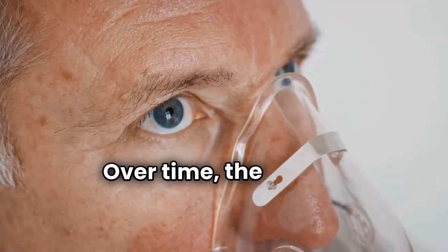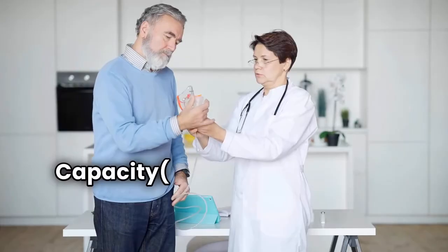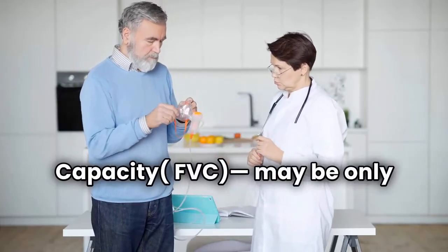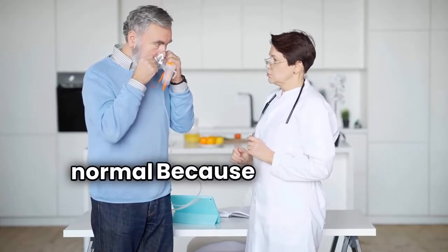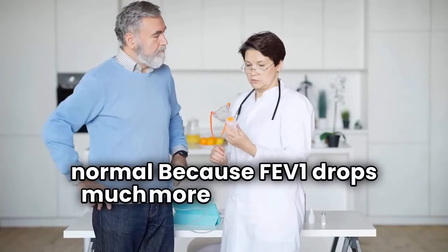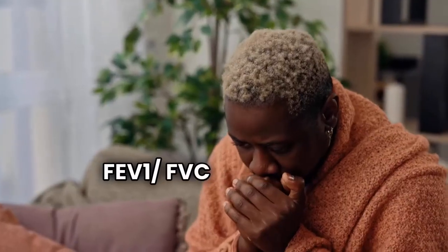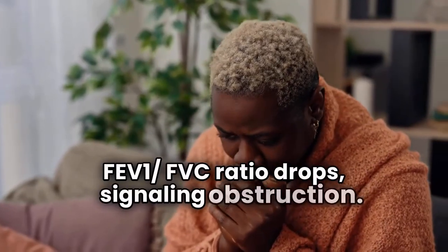Over time, the person may still be able to exhale most of the air, so the forced vital capacity (FVC) may be only mildly reduced or even normal. Because FEV1 drops much more than FVC, the FEV1/FVC ratio drops, signaling obstruction.